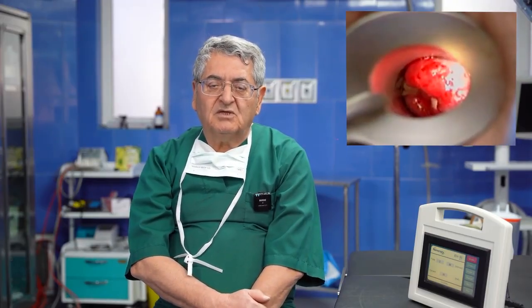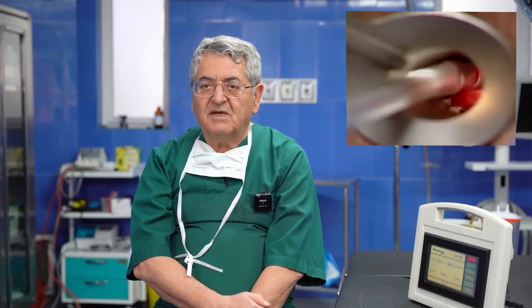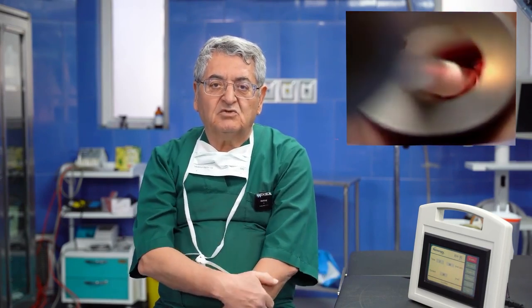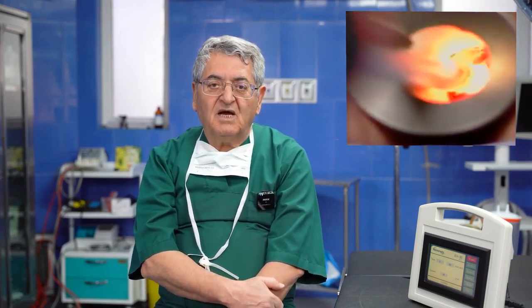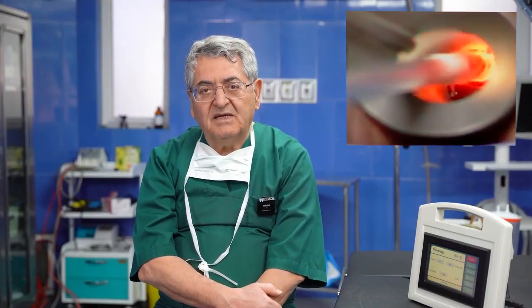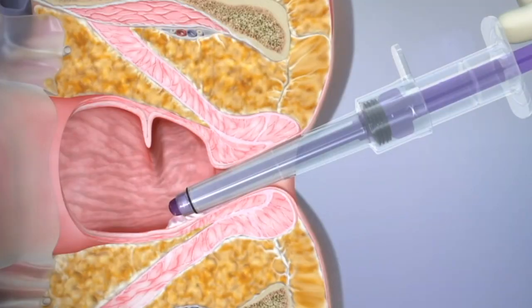In the case of infrared, the electrode or the emitter is placed on the hemorrhoidal mass, and about 3 millimeters of tissue around and in depth is destroyed. Therefore, a large hemorrhoidal mass must be treated with the emitter in different areas, and this method is not particularly effective. Another treatment is the use of elastic band ligation.